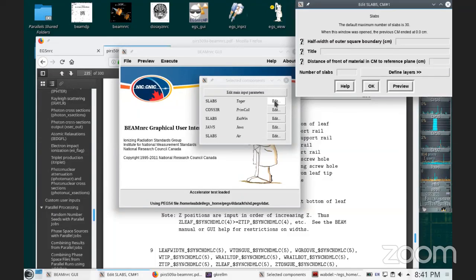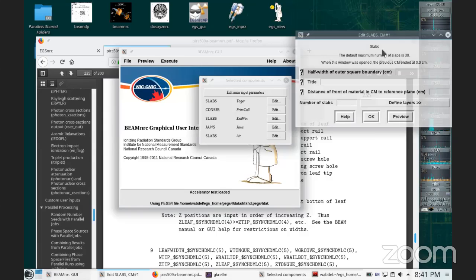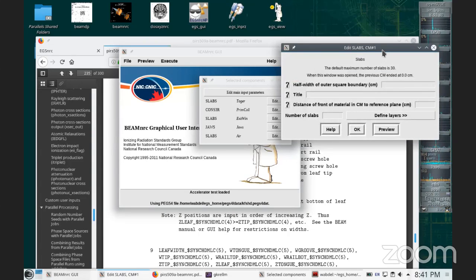What do the other options during compilation imply? Most times we use optimize, I don't know. That's basically the optimization level. So optimization 2 is usually what we use. Optimization level 3 is different. That's something related to the compiler. Okay, I did not write the compilers. I don't know what they mean, but I know the EGS.